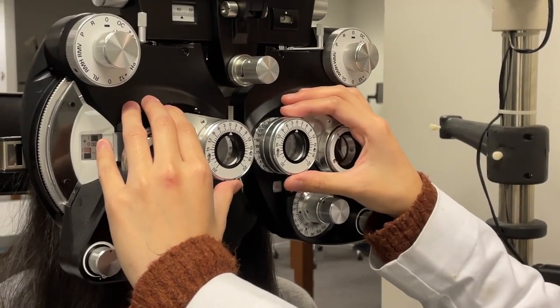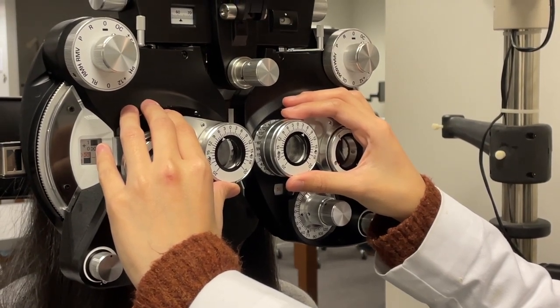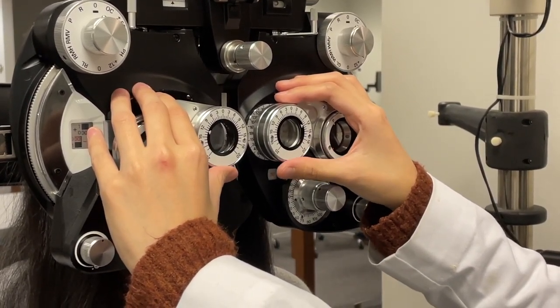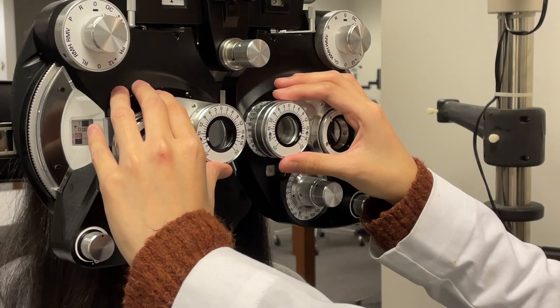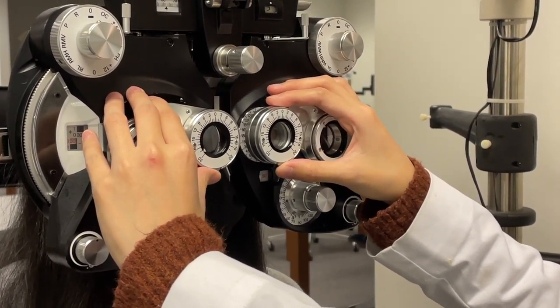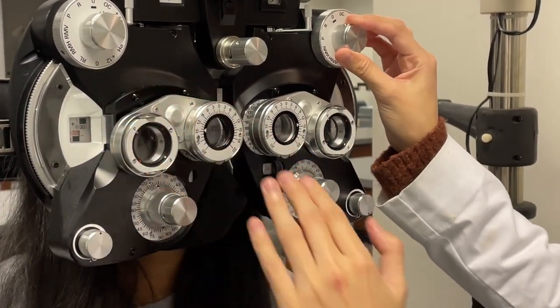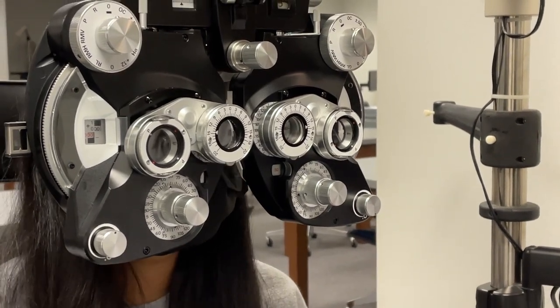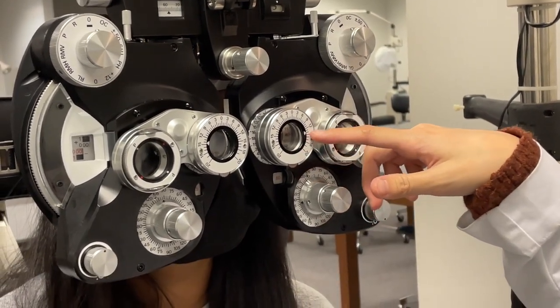All right, Mrs. Lee, now I'm going to do base out ranges. You let me know when it becomes blurry, break into two, and then back as one. Still clear? Mm-hmm. Two. Okay, let me know when it comes back as one. And one. Okay. Base out ranges are 19 times 2, which is going to be 36. 38. Can't do math. All right, so base out ranges are going to be 38 and then back as one at 26.